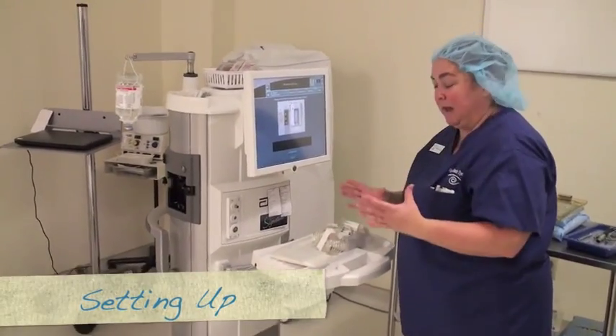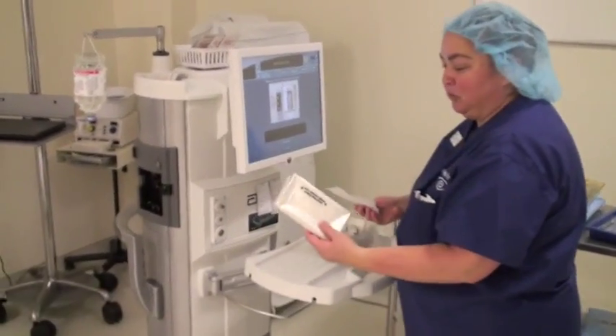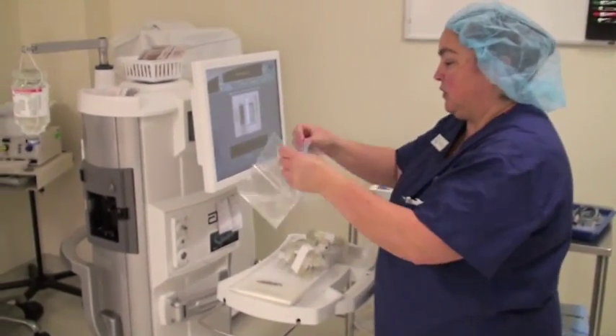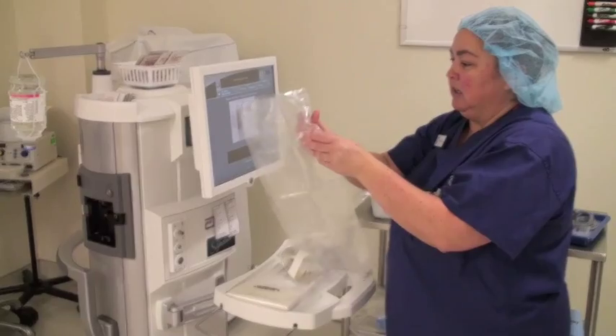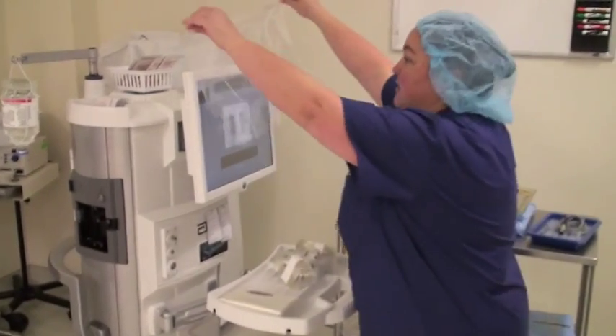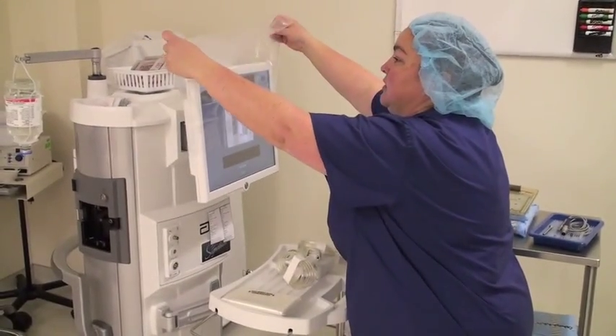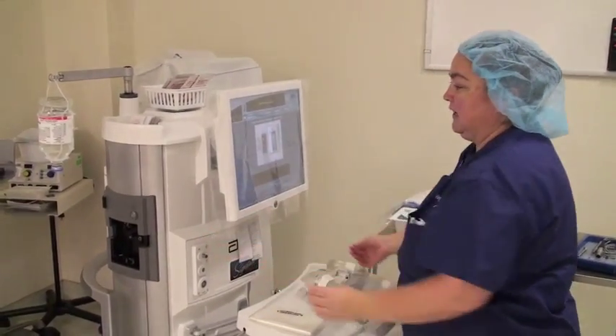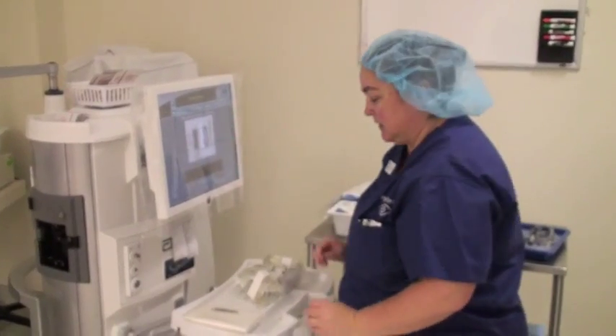This is the tubing that comes in the packaging. This is your tray ring cover that will cover your tray here. This little drape goes over your screen, so you're able to touch it in a sterile manner. You just open up the drape and put it over the back like that, and it just hangs there, so this way you can touch it and everything's sterile.